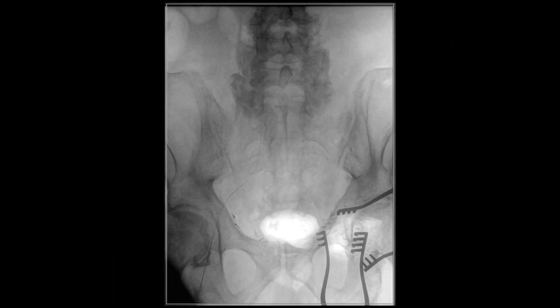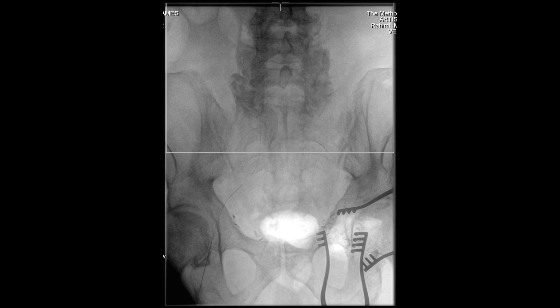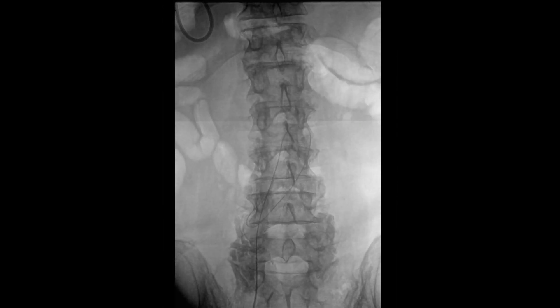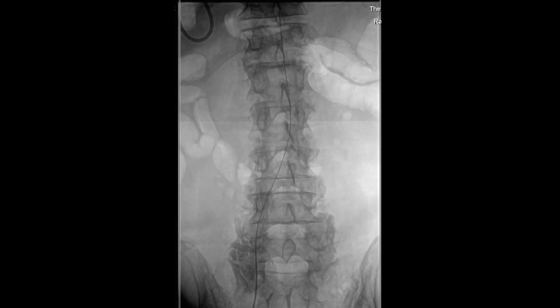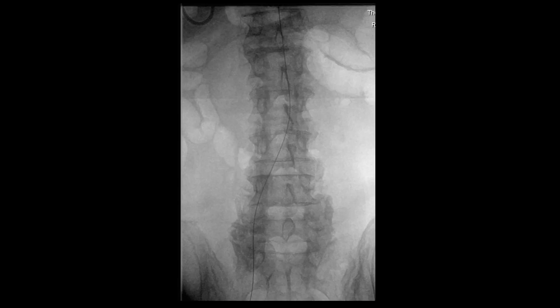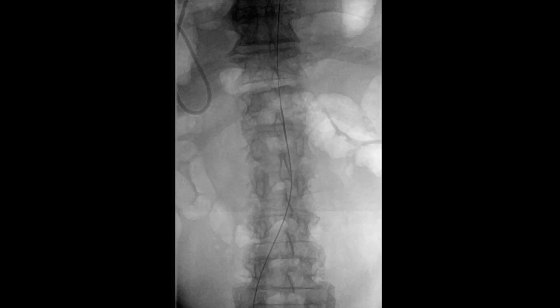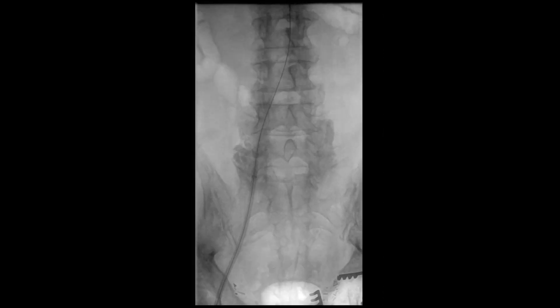A mini-stick needle followed by a micropuncture wire and sheath were used to access the right common femoral artery. A Benson wire was then advanced into the descending thoracic aorta. It was then upsized to a 12-French sheath using a super-stiff Amplatz wire on the right side.